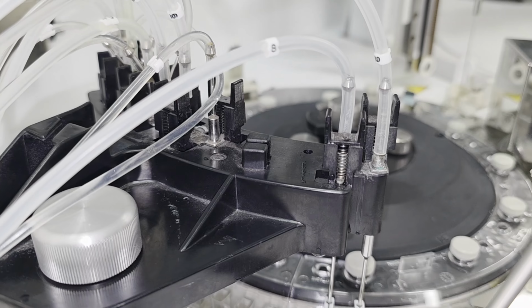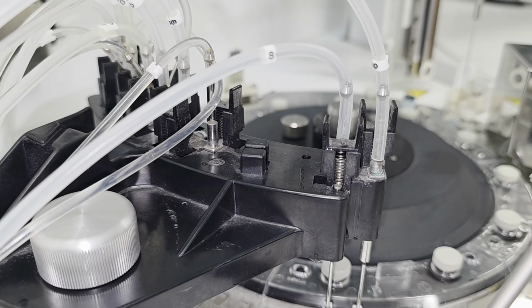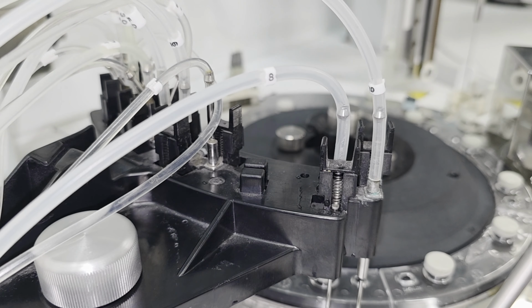This is Mr. Biomedical, and in this video we are going to see about the water splashing, as you can see, from the C311 analyzer. In this case, it is very easy to solve, but still, for entry level biomeds it can be useful. So let's see how to do that. It is very easy to do.